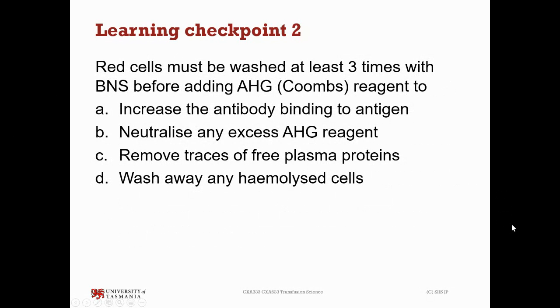Red cells must be washed at least 3 times with BNS before adding the Coombs reagent. Have a look at those 4, and again, I'll set the poll up for you.